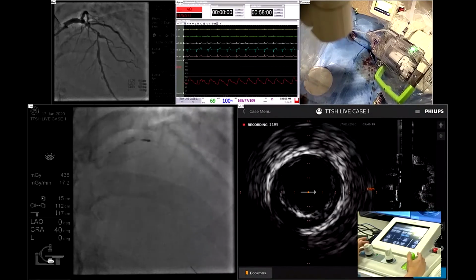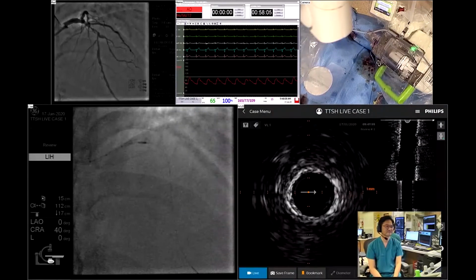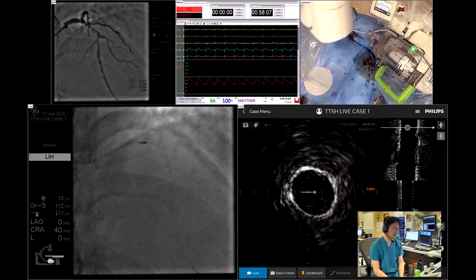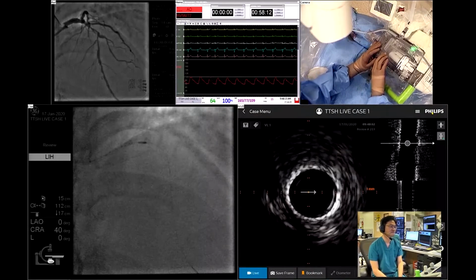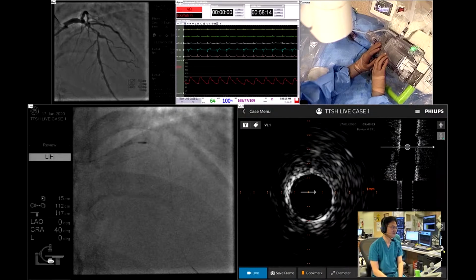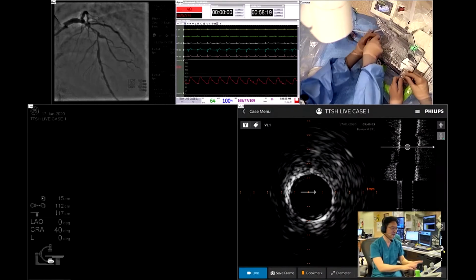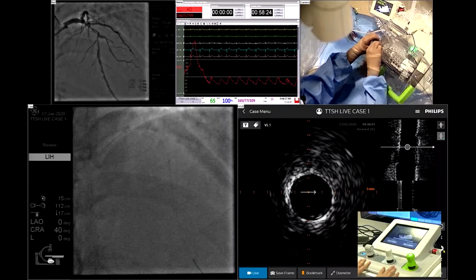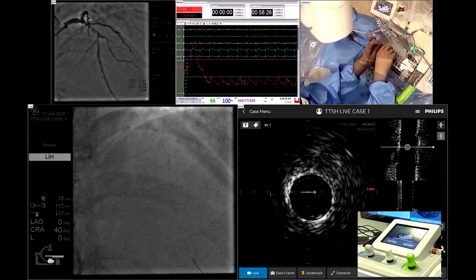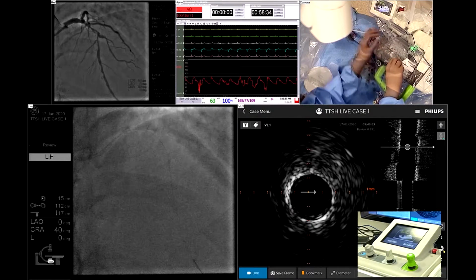This is Dr. Nimit Shah. If I can ask, while you were pulling your IVUS back, we could see the guide sucking in. Can you control that as well? It did. Yeah, but did you see I actually at the same time pulled the guide out? So I have simultaneous control of the wire, the guide, and the device. When I'm pulling back, I didn't like the wire being too far, so I actually at the same time pull the wire back. When the guide gets sucked in, I can at the same time pull the guide out. I can actually do all that.